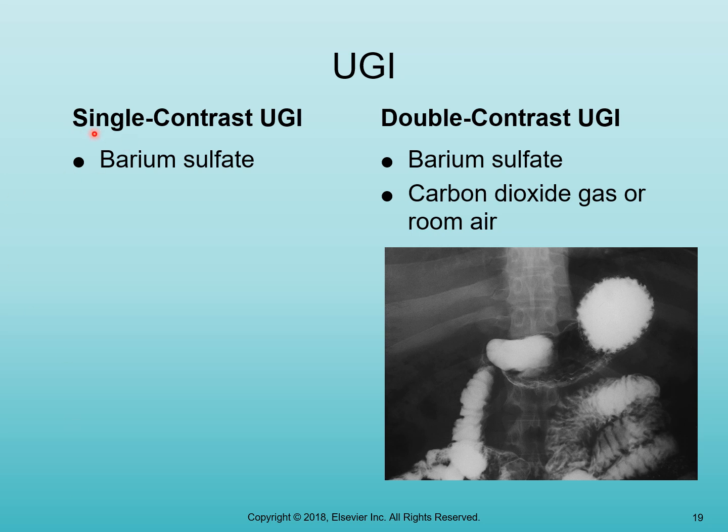So single contrast means one contrast media, and I know it lists barium, but it could also be the water-soluble iodinated contrast.